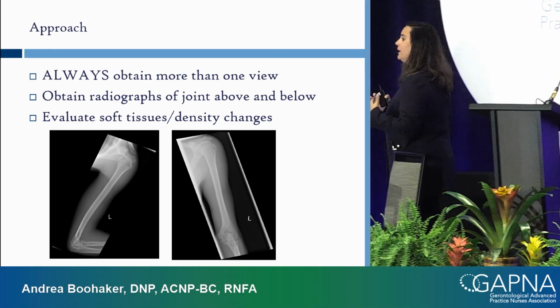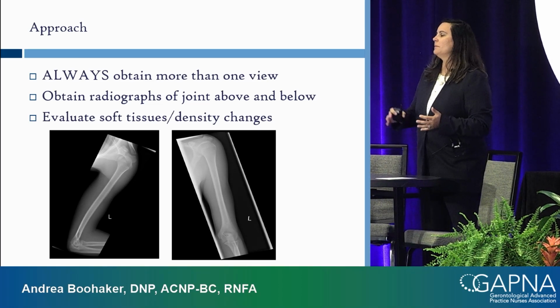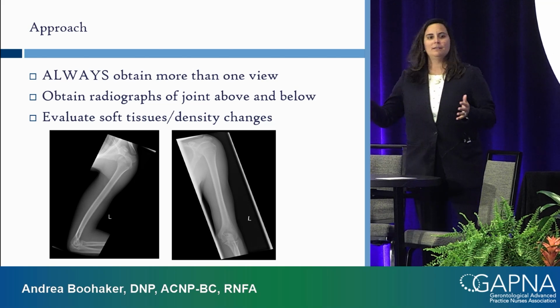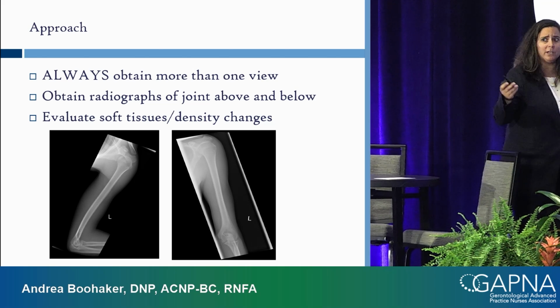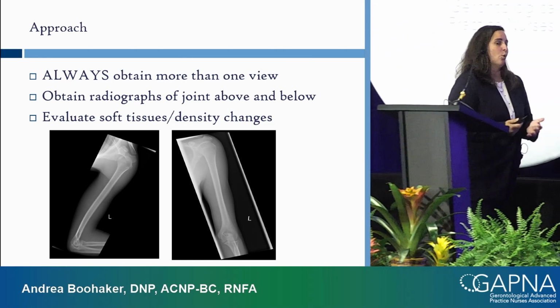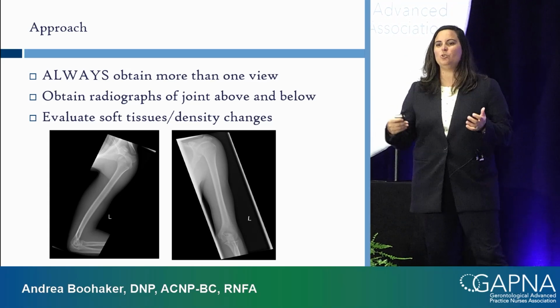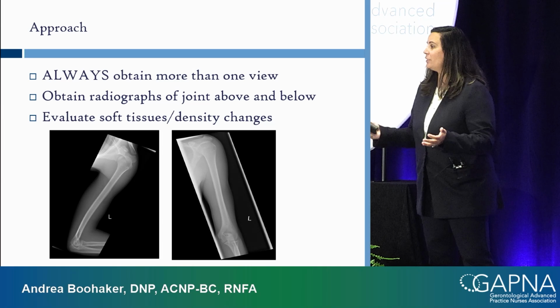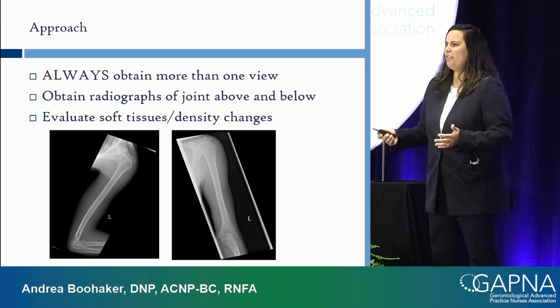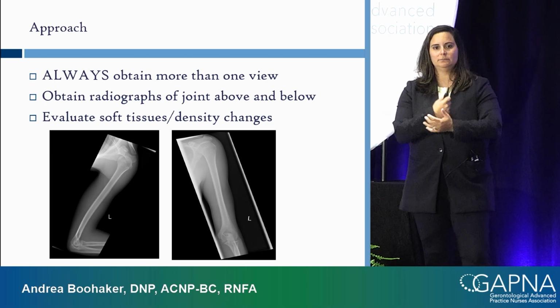Patient comes in complaining of knee pain, okay? They fell while walking on a curb, kind of twisted their knee, and then started walking a little wonky, all right? They come to the office, you get an x-ray of their knee, right? They're complaining of knee pain. Pretty normal, not terrible. You're doing your exam, you look at the x-ray, say, hey, this doesn't look that bad. What else is bothering you? Actually, nothing. My ankle kind of hurts here and there, but not terrible. So you send the patient out.